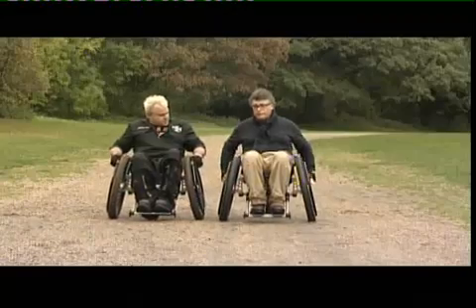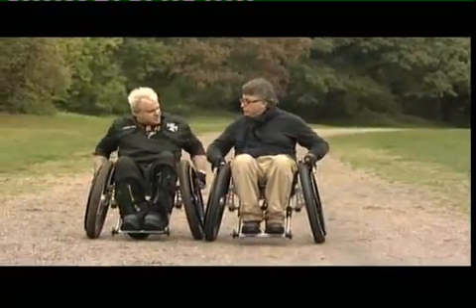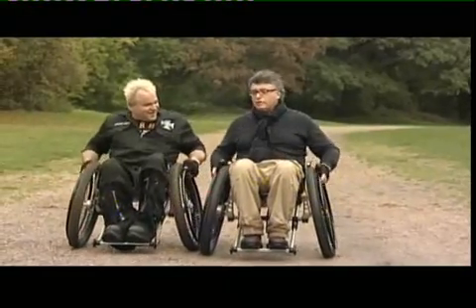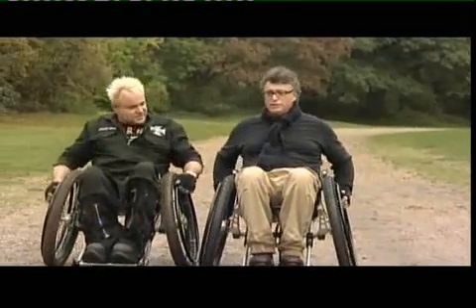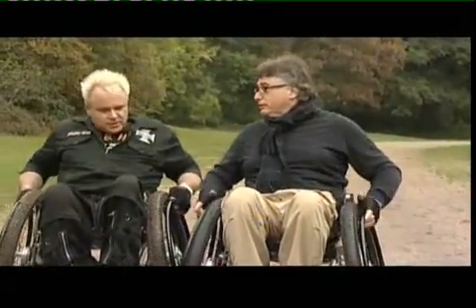No, when we first started testing the Trekinetic, it became pretty obvious straight away that it was like twice as fast over rough ground. But the trouble is, as the ground got rougher, it just became more and more unsteady. In fact, it was completely unstable. I felt sick, really. I'd gone from thinking that I'd reinvented the wheel to this kind of really grim realisation we were on the verge of losing everything.